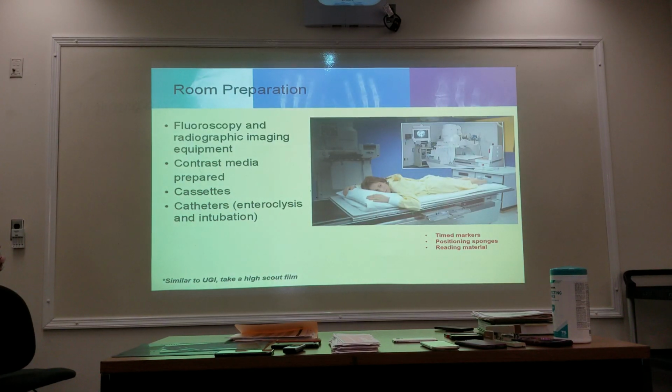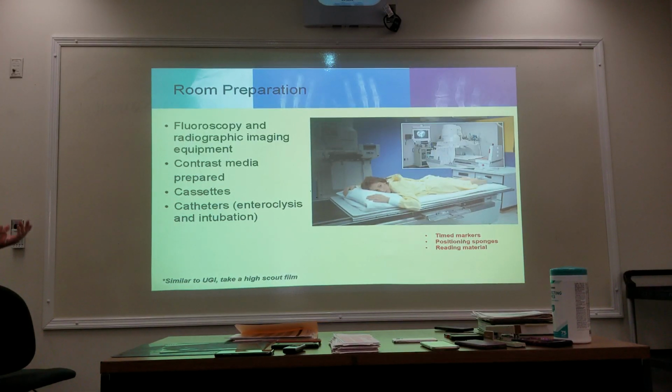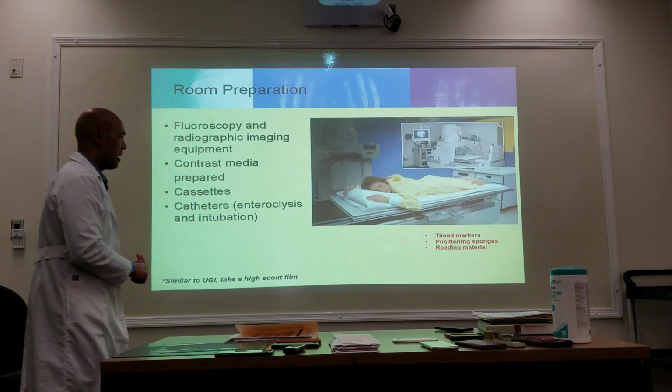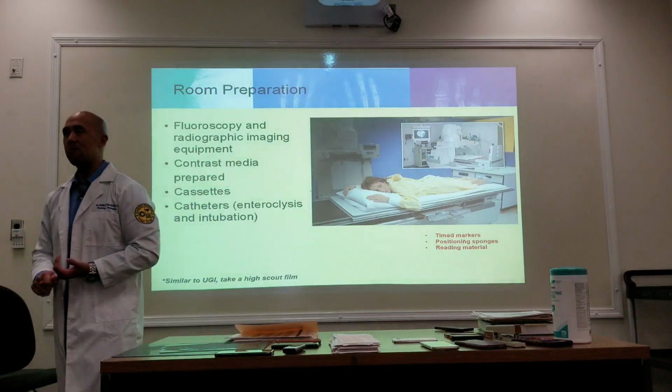So you want to make sure that bucky is slid all the way down at the end of the table. So we have fluoroscopy and radiographic imaging equipment, contrast media, your image receptors, and if we're doing any type of catheter procedures, have your enteroclysis or NG tubes available. What you're also going to need here is timed markers.